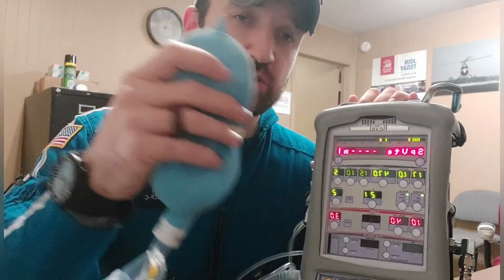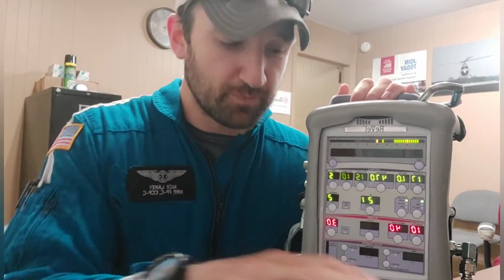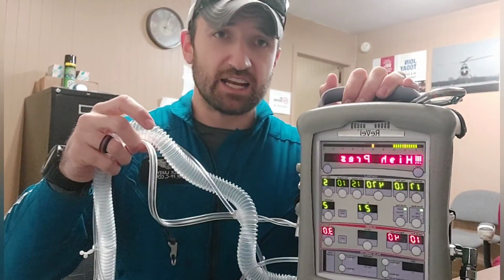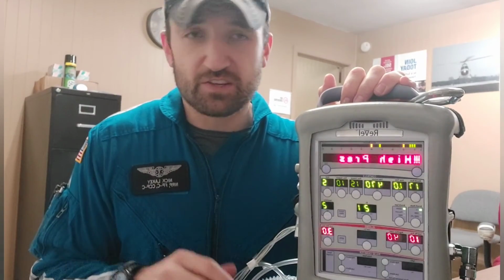Okay, now quick demonstration here. So if I were to in any way impede the flow here, you see I'm going to get a high pressure alarm. Now what the ventilator's sensing is that I've got a decrease in compliance somewhere. So the first thing that I would do is I'd come down and I check this circuit. Now you can see it's relatively long, and especially when you put it inside of a vehicle or there's a lot of providers nearby, there's a high likelihood that this could get kinked off and it could cause this high pressure alarm. So I'm going to examine my circuit all the way up to the patient and all the way up to the ET tube and make sure that that circuit is in the right spot.